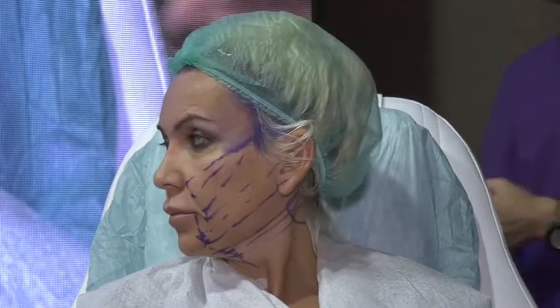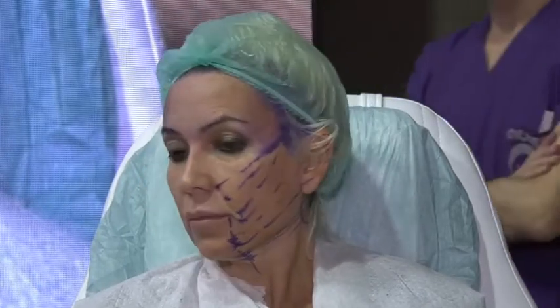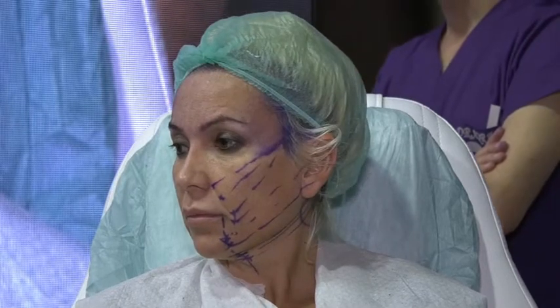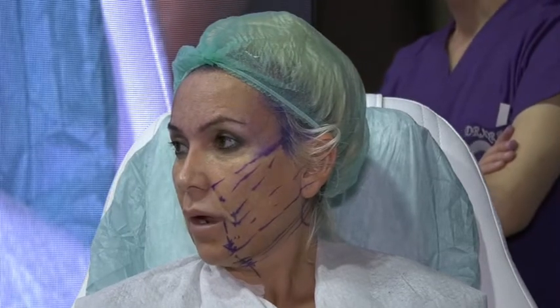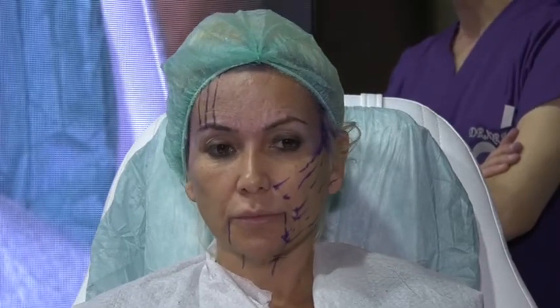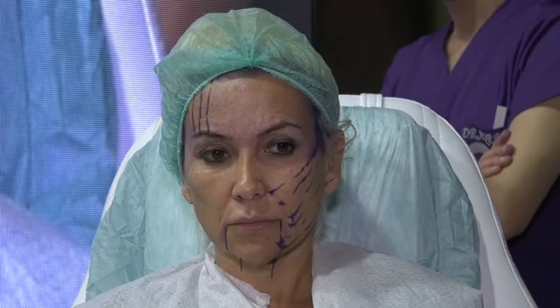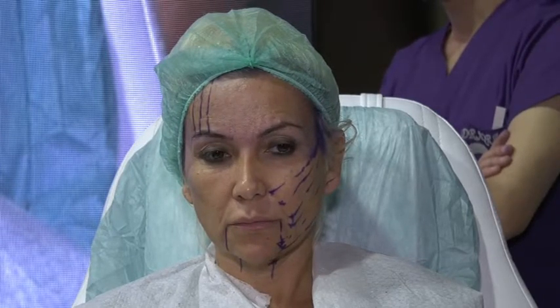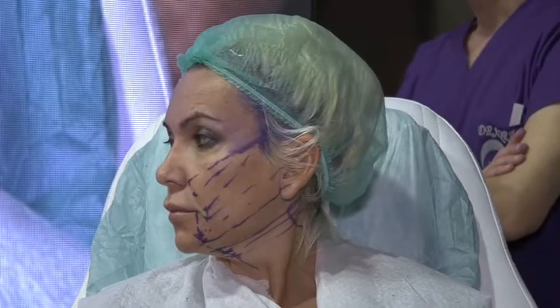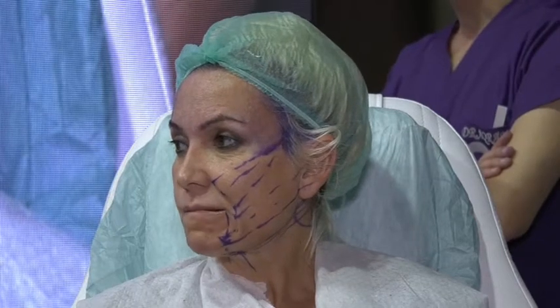But for the first thread, if you have difficulty, we will show now how to maneuver the difficulty, and try to be patient and to adjust your angle. Sometimes, when you go more up, it's more difficult. If you find you cannot pass, go back a little bit, change your angle and go more down. Instead of finishing here, try to finish 1 centimeter down. You'll find it easy to pass. Consider that number 1 is number 2, number 2 is number 3, so we go a little more down and you will not have this difficulty. So this is also another solution.